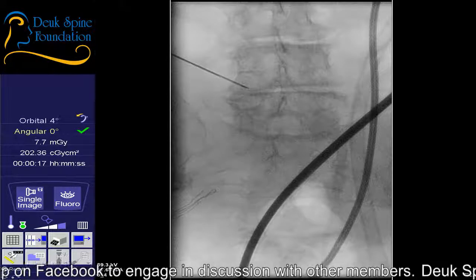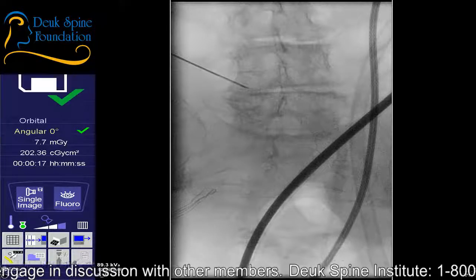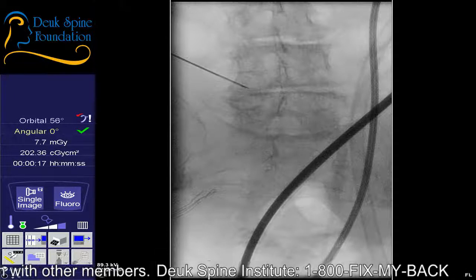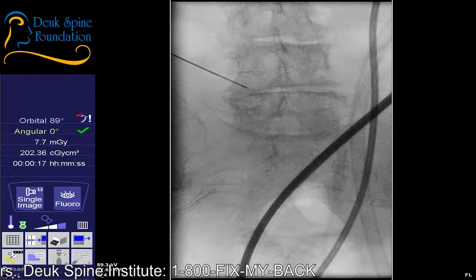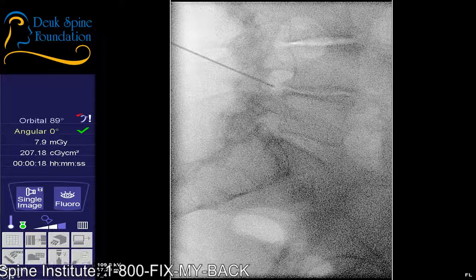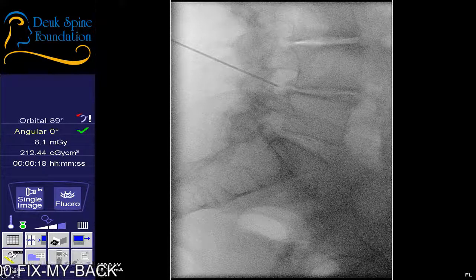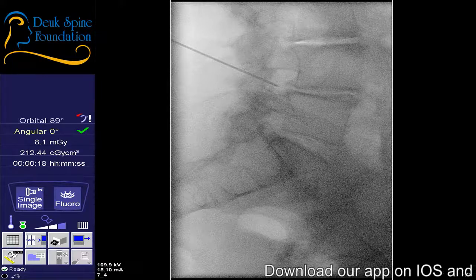Perfect, absolutely perfect positioning. Now you can see the tip of the needle is in the mid-pedicular line. Go back to a lateral, please. So I'm hitting something, right? But you're not seeing it on the x-ray. Why? Because x-rays really are better for seeing bone, hard things like bone or foreign bodies. And you can't see herniations on an x-ray unless they're really calcified. And so I'm actually hitting the herniation right now with the tip of the needle. It feels like a herniation to me. The problem is I'm not entirely happy with my trajectory, but I'm going to give it a go and see what happens.